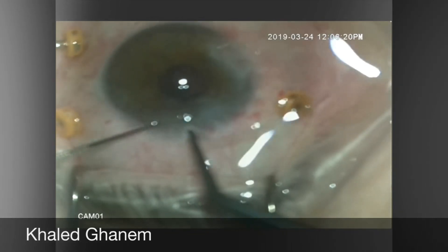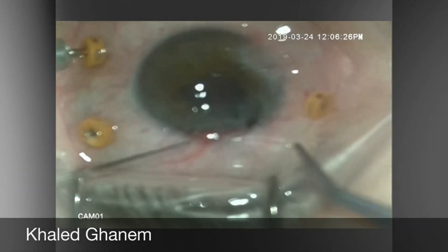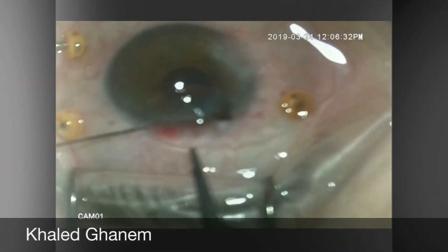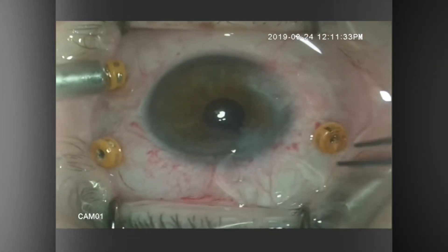So if you are planning to explant the IOL, I recommend just exteriorizing one haptic and extending the wound. It will be much easier than delivering the entire IOL into the anterior chamber before explantation.